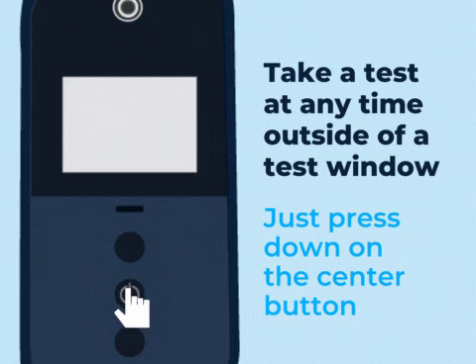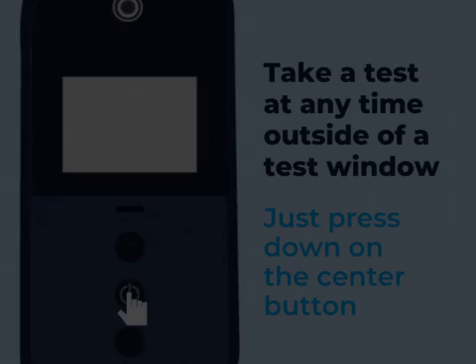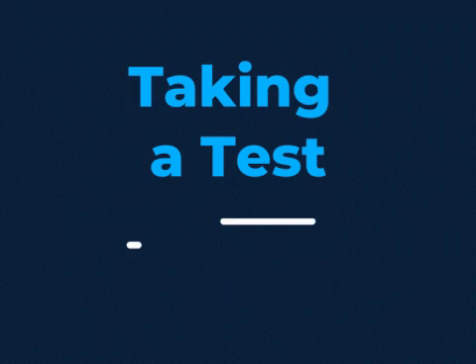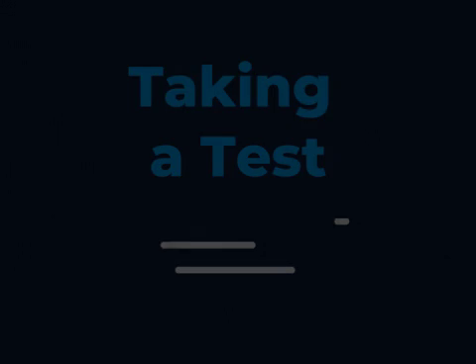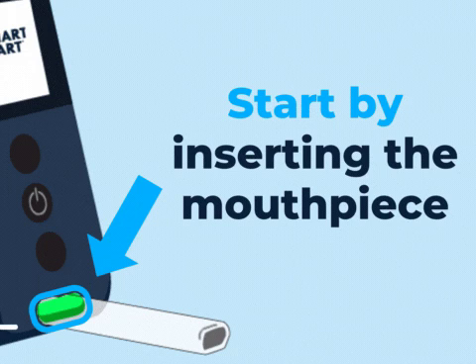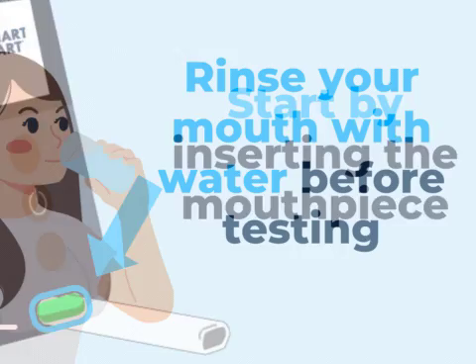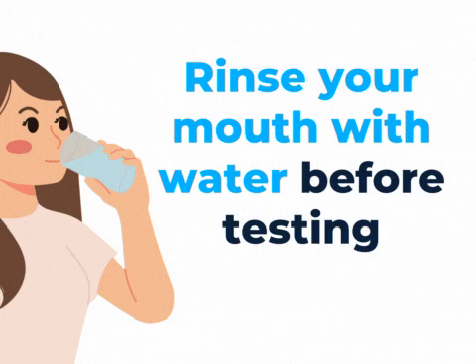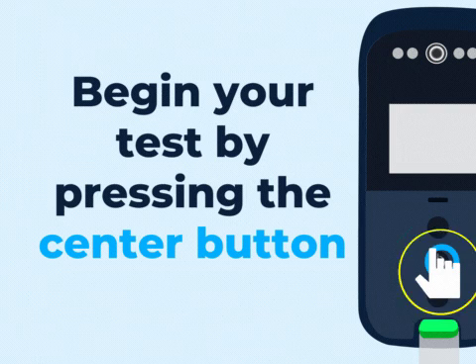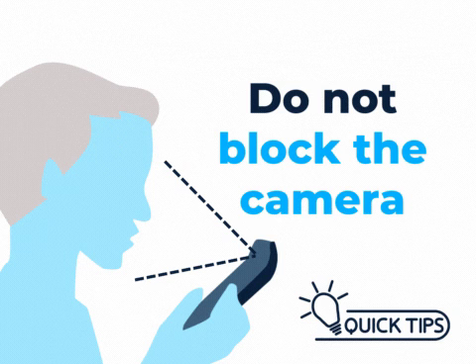Just press down on the center button. Start by inserting the mouthpiece into the device. It's important to rinse your mouth with water before testing in order to ensure an accurate reading. Begin your test by pressing the center button. Hold your Smart Mobile Insight as shown and do not block the camera.